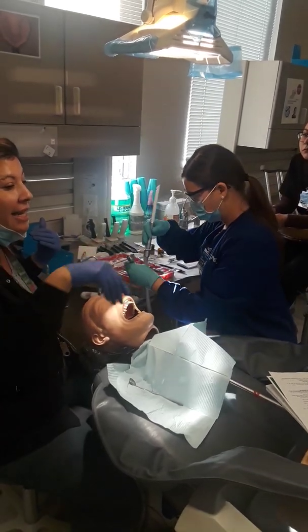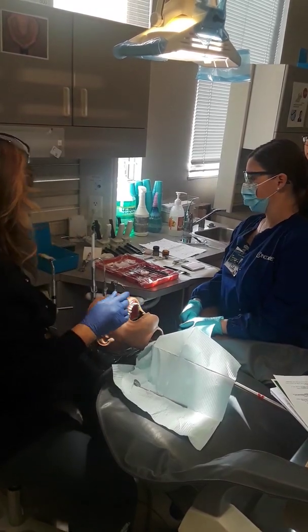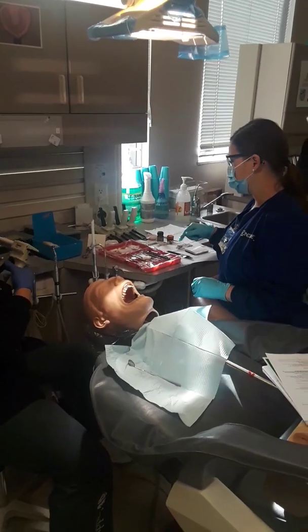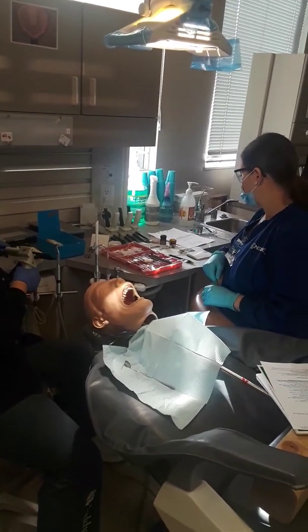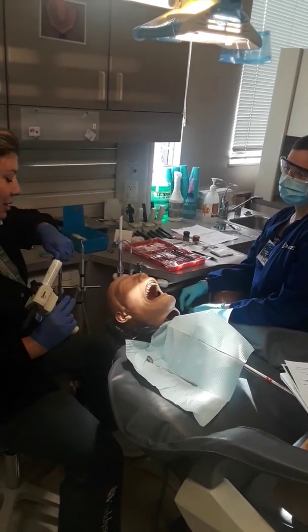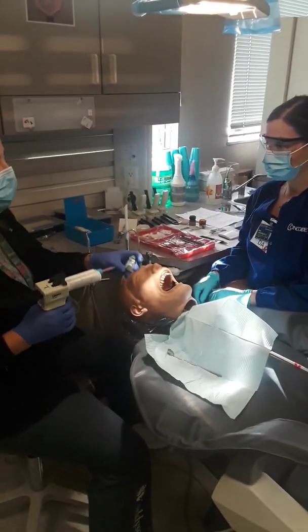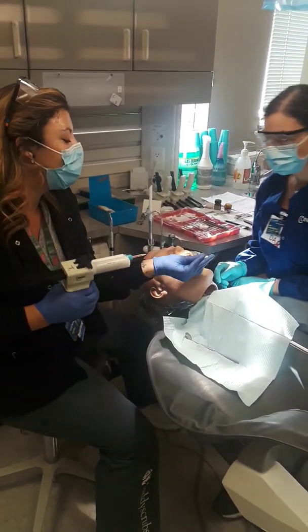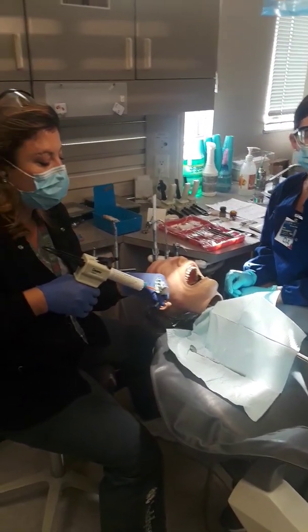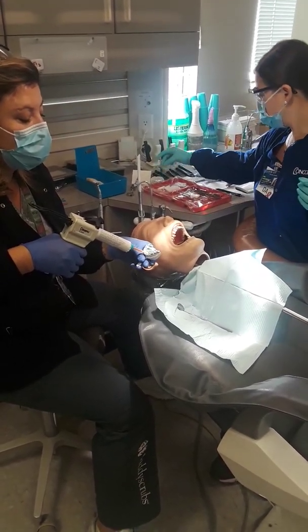We're going to fabricate a temporary crown. Temporary crown, please put Vaseline around your prep. Yeah, I'm going to make a crown real quick. So I'm going to show you how fast this is to make. So you want to make it pretty fast. It's during this appointment. So I'm going to make sure you put it in the right tooth. This is acrylic material. If your office has this type of material, you'll make crowns fast.